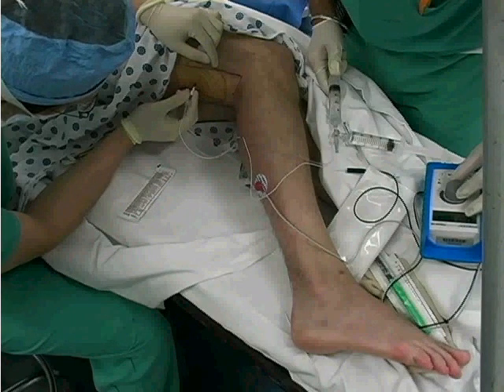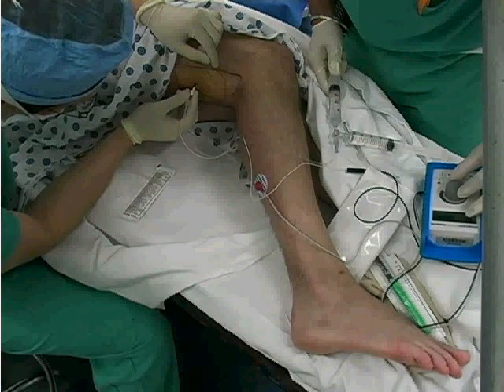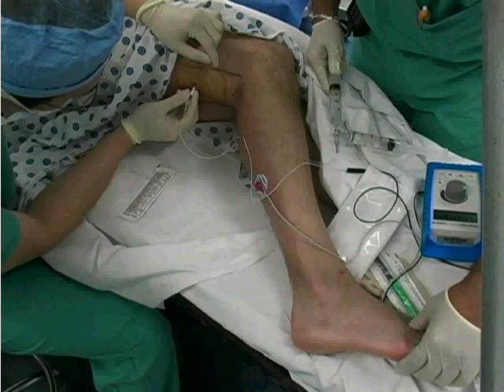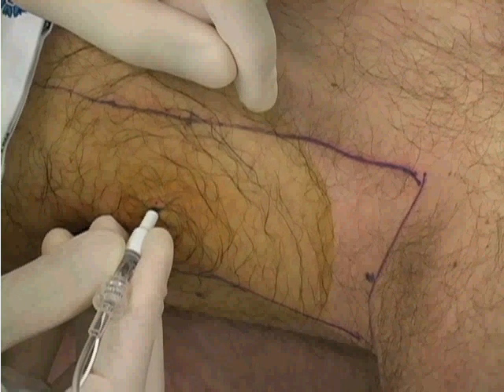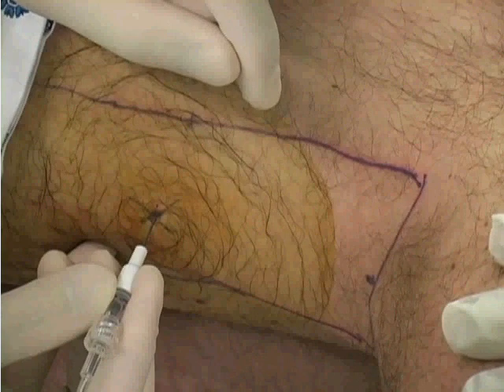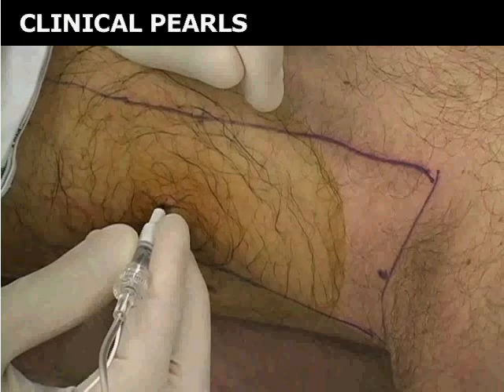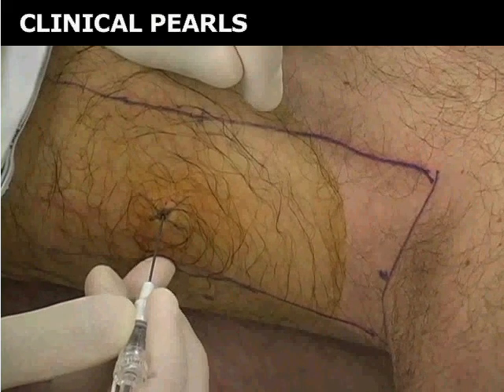Continue to monitor the muscles for twitching. Maintain nerve stimulation at a current level of 0.2 to 0.5 milliamps. The proximity of the stimulating needle to the two nerves, as indicated by stimulation at a low level of current, increases the likelihood of an efficacious block. If nerve stimulation is lost as you decrease the stimulating current, slowly redirect the needle to regain muscle movement. If you have difficulty attaining muscle twitching of the calf and toe flexion, bring the needle back to the skin and redirect it 1 cm laterally.